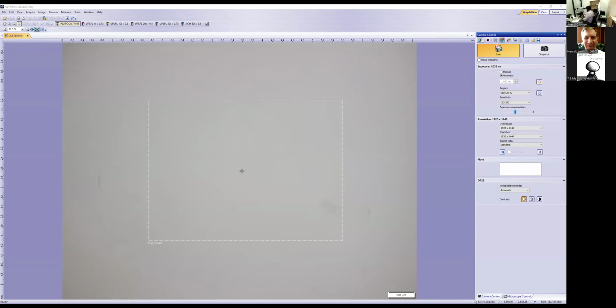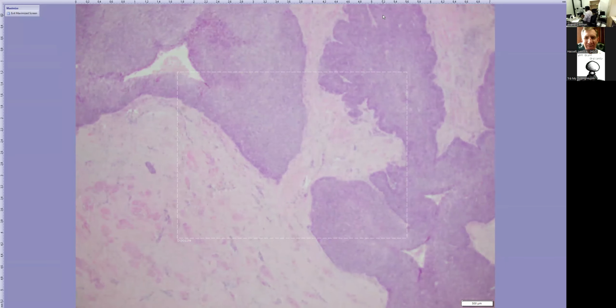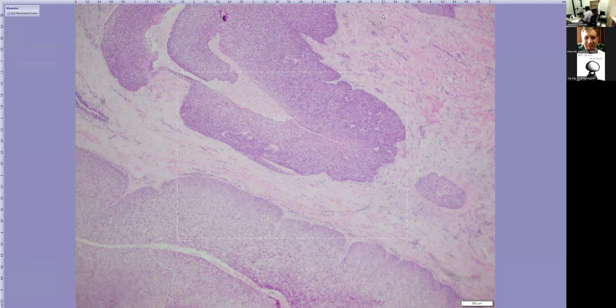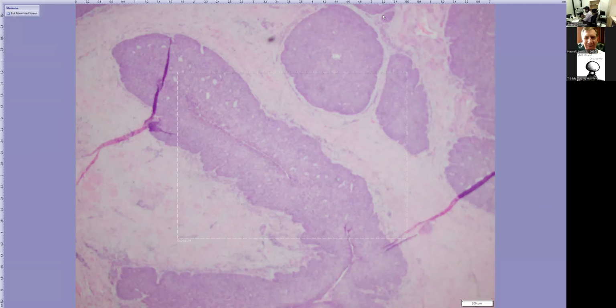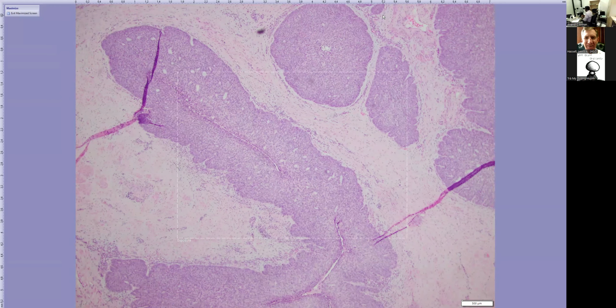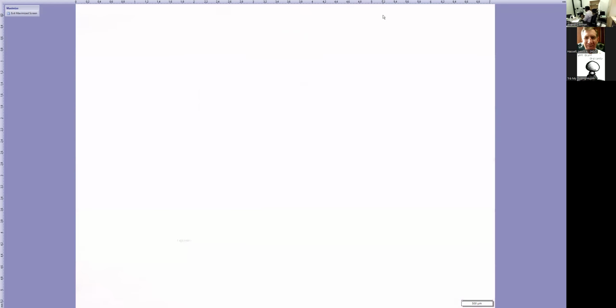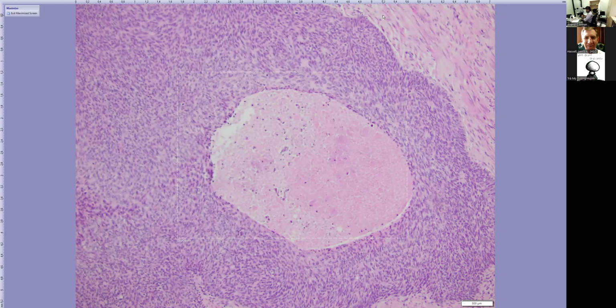All right, so this one is the cystectomy specimen with anterior vaginal wall resection, and here's the histomorphology of this tumor. As you can see, as I scroll through low power, the tumor is looking bluish, which means they are a little bit basaloid, and they also have these cystic spaces. In some areas, there's necrosis within the cystic spaces.